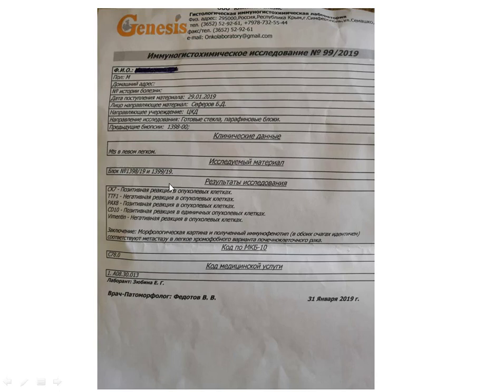Conclusion of the immunohistochemical investigation: cytokeratin 7 positive reaction, TTF1 negative reaction, PAX8 positive reaction in tumor cells, CD10 positive reaction in focal tumor cells, vimentin negative reaction in the tumor cells.